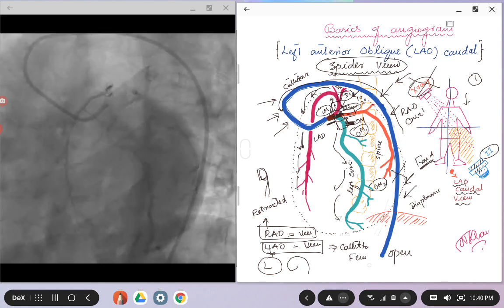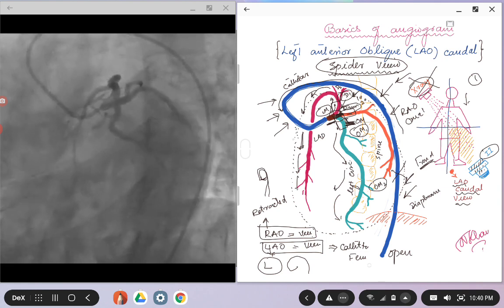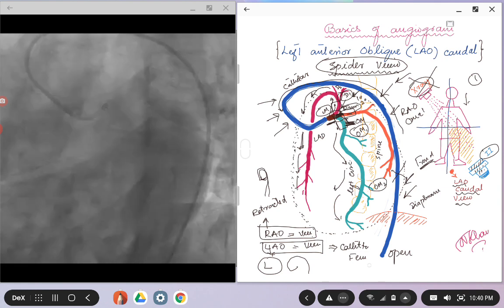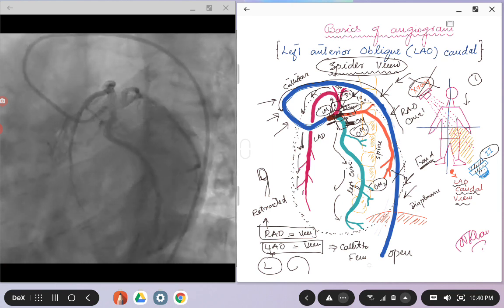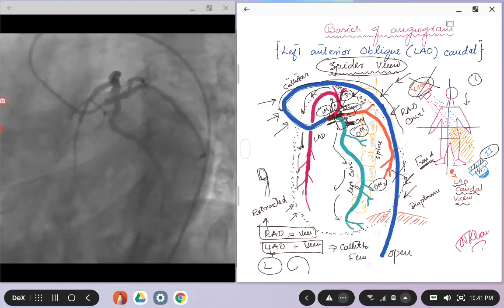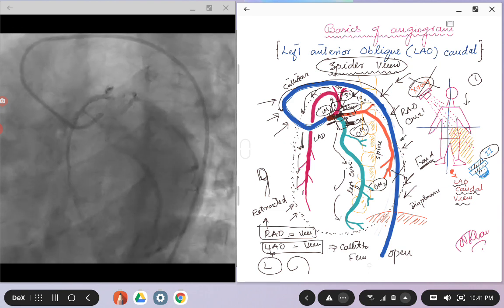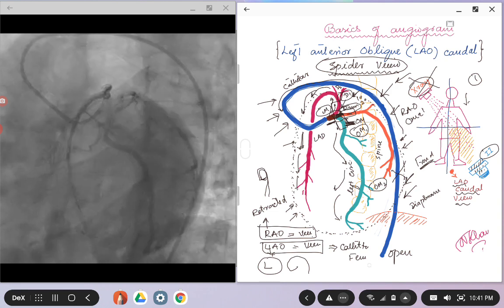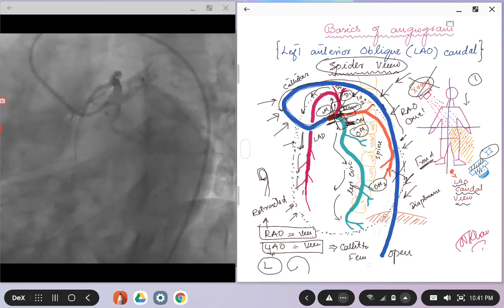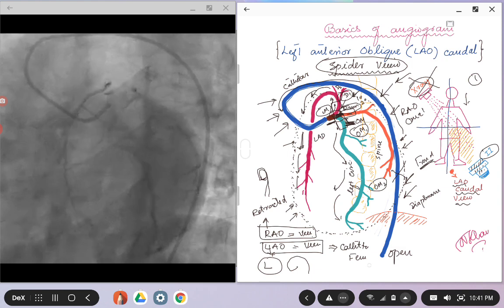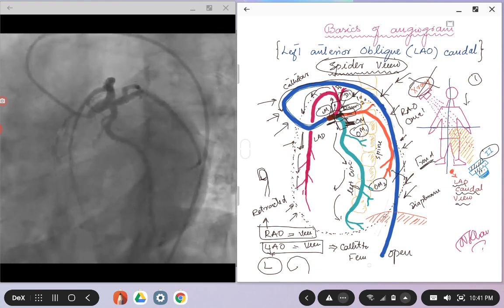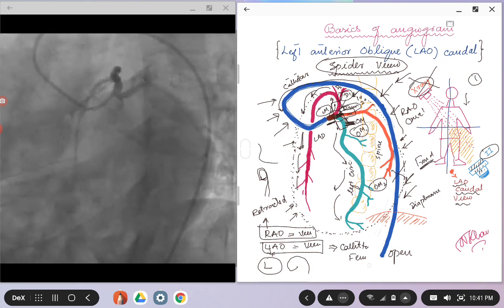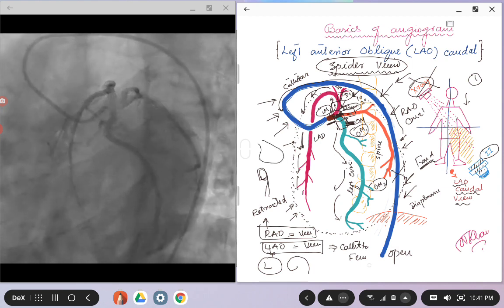So if you see on the left image, you can see the heart shadow as well. I just here, I kind of dotted it in this picture here. These are the borders for the heart, and you can see that it's kind of rounded in shape, just because, as we talked about, in the caudal views the heart is not opened up. And as we will move along in the other images, you will see a very nice boot-shaped heart in the other images.